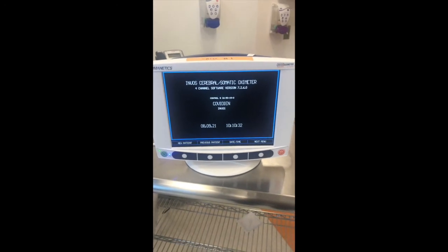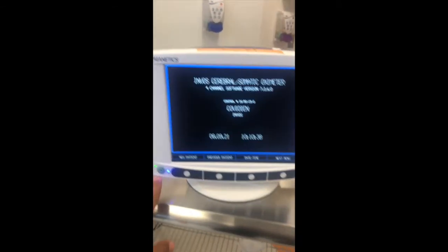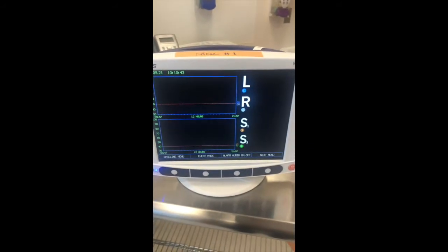If you had to restart your monitor for any reason — for example, you closed the monitor for an MRI — after reopening the monitor, instead of creating a new patient, you can simply click previous patient and right away you're ready to restart recording.